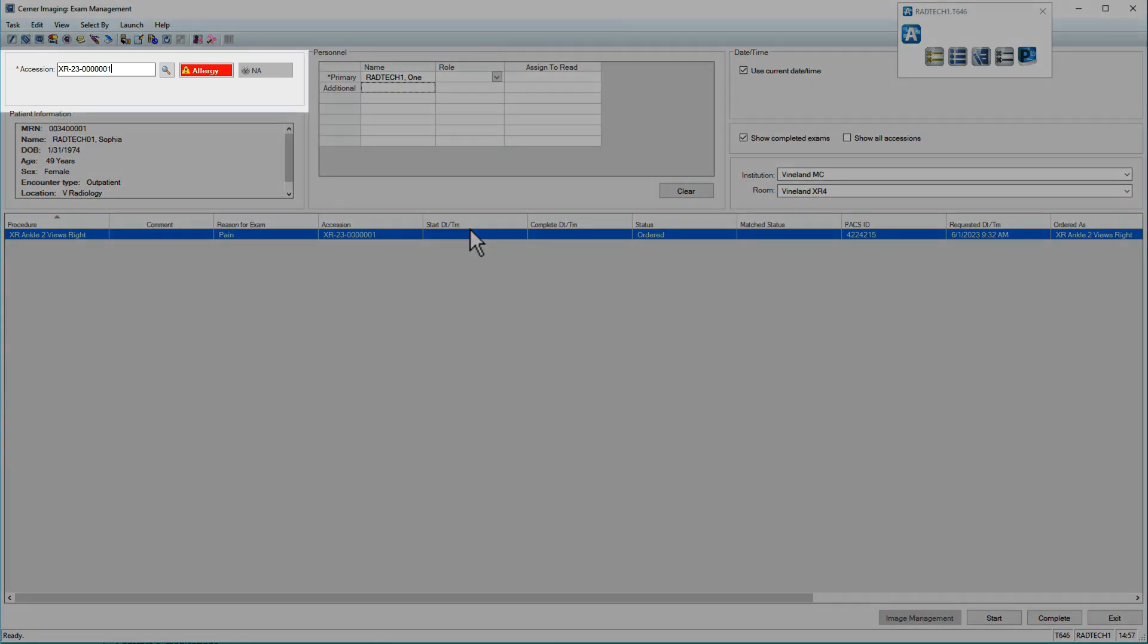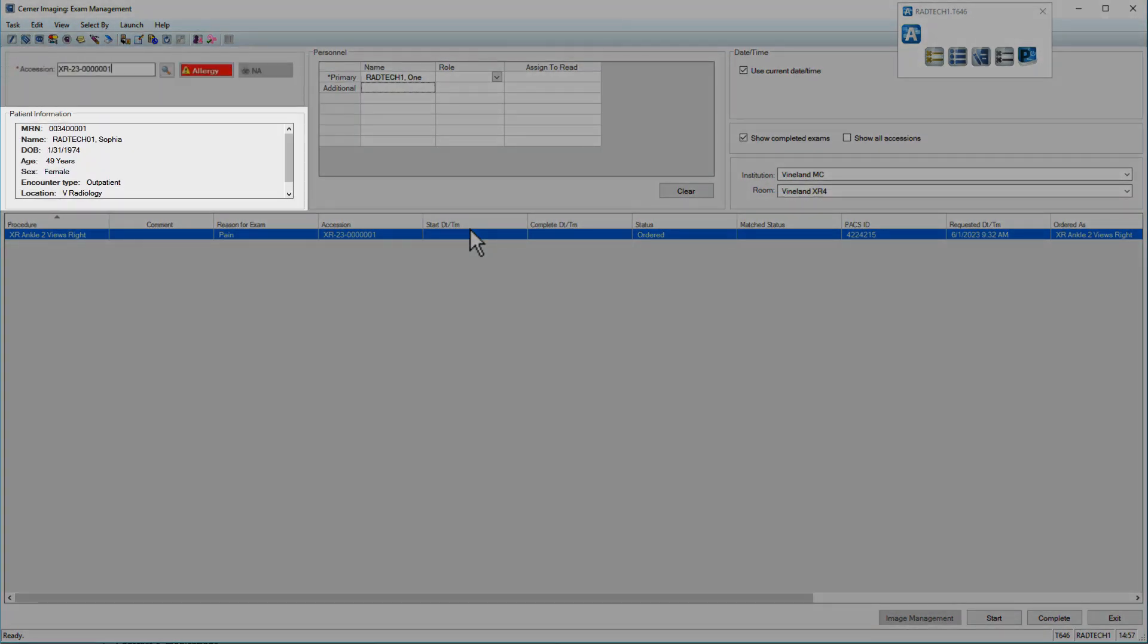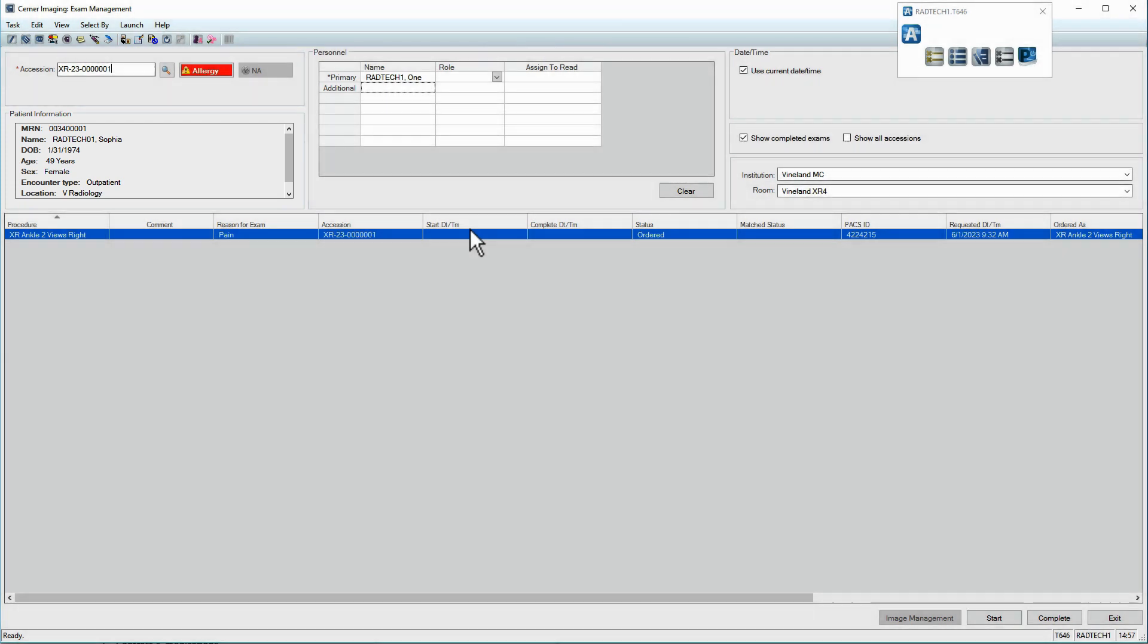The accession displays in the upper left and patient information displays below. First, ensure all personnel are appropriately recorded in the personnel section.